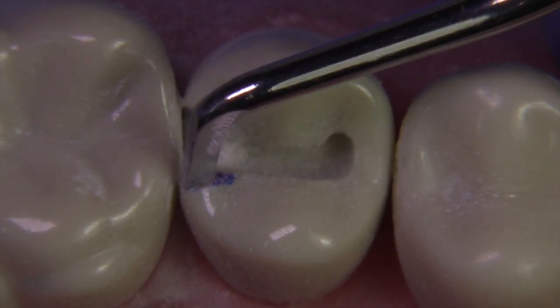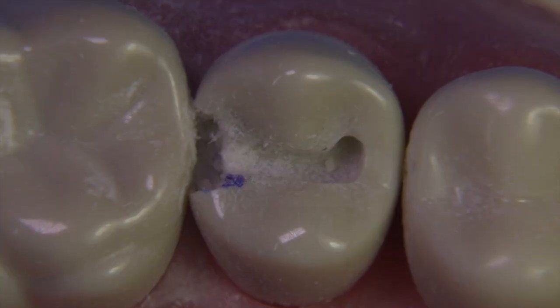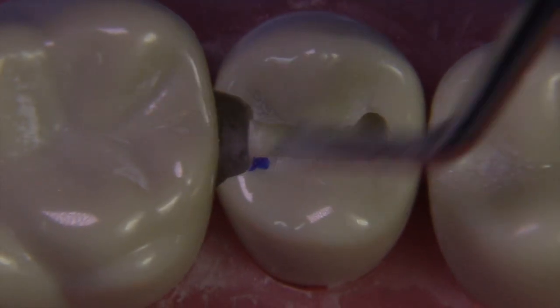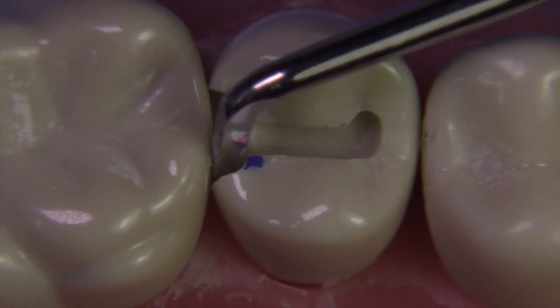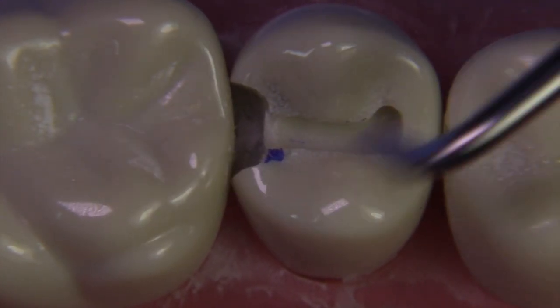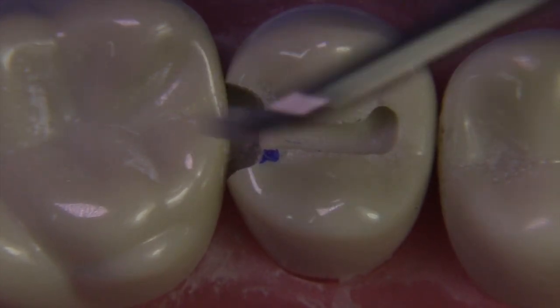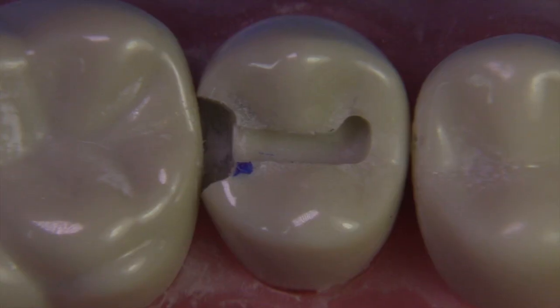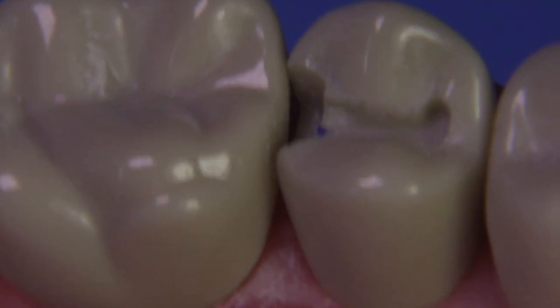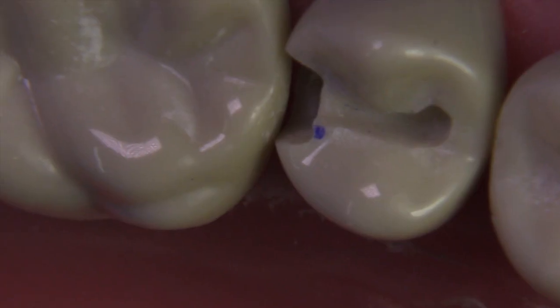So this is just the nature of this particular preparation — undermine and chip technique. It can feel nerve-wracking, but you have to keep going. This tooth seems to move orthodontically distally — I get clearance, then go back and have less clearance because it's such a tight contact. You could adjust the tooth to make it a less tight contact, but what if you don't have that option? If you can manage the DO on tooth number 4, which is much more difficult than the DO on tooth number 13, you can do just about anything.